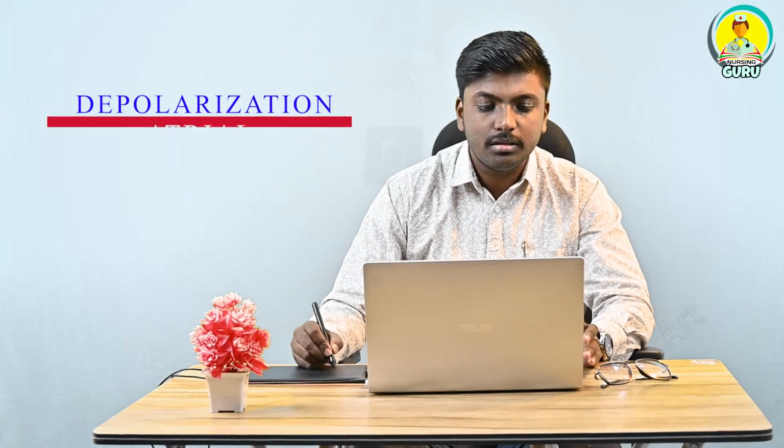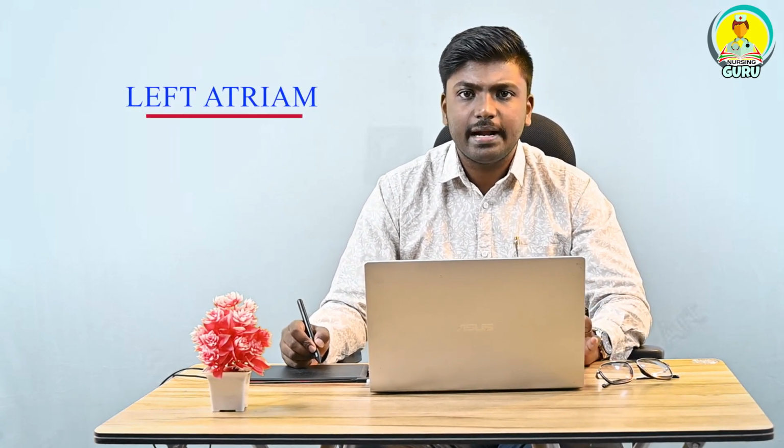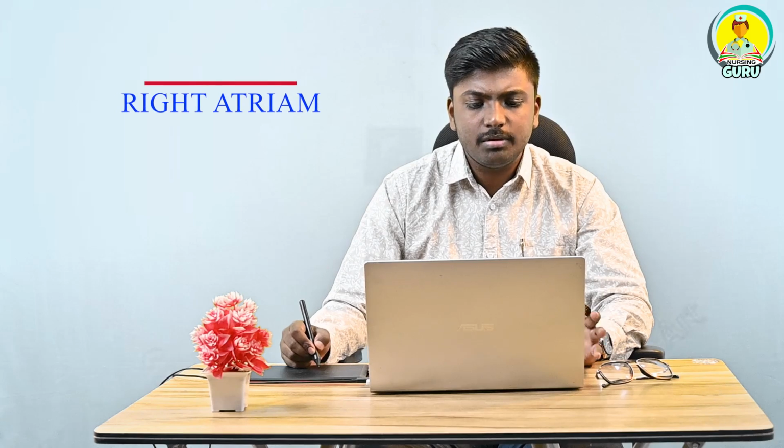P stands for atrial depolarization. When the atrium is contracting, whether it is the left atrium or right atrium, that is called depolarization. So it is represented by P.